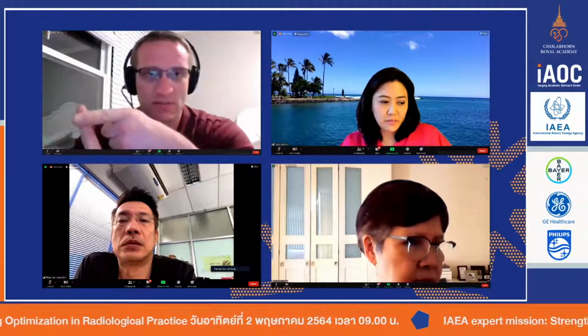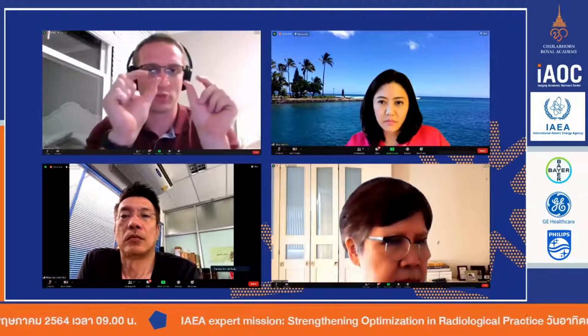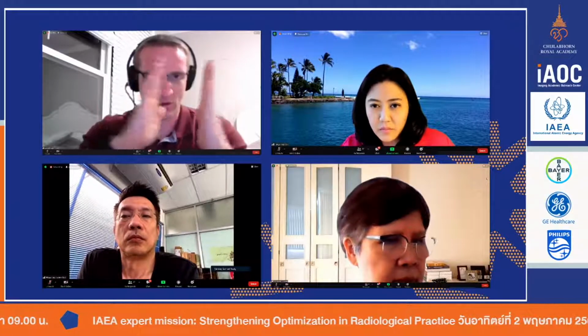But if you do this, I highly recommend using grids, because you can set it up so that the patients are either seated or standing erect, and you can get the grid in a good location. You make sure everything is perpendicular. You keep the patient as close to the detector as possible so that we can improve the spatial resolution. If we are off, remember the magnification: we get an anatomy that's magnified, but we also blur the edges of the anatomy. So the closer we get the anatomy to the detector, the better. Good collimation obviously makes for better gray-white imaging.